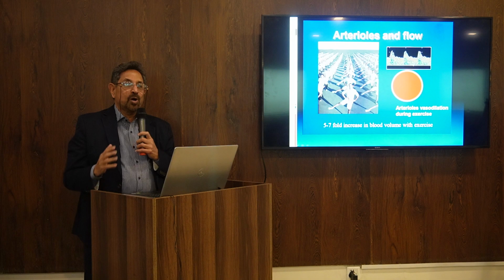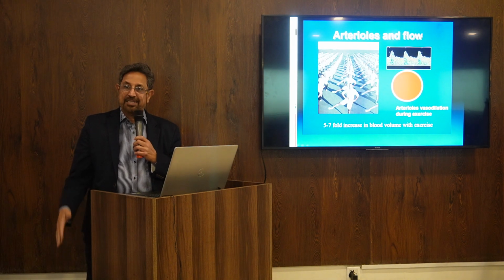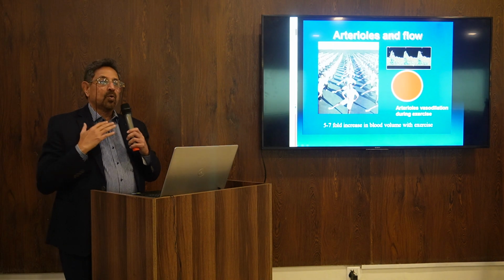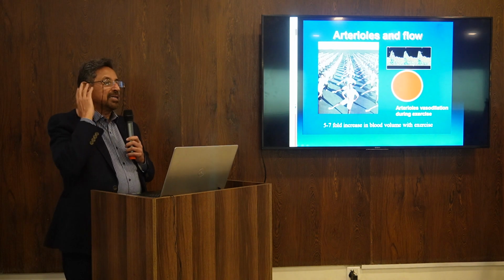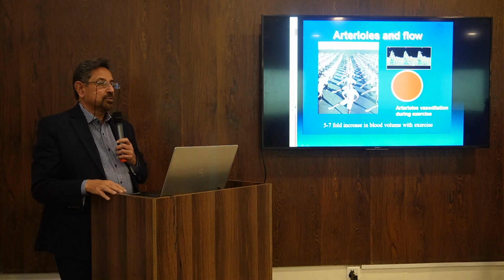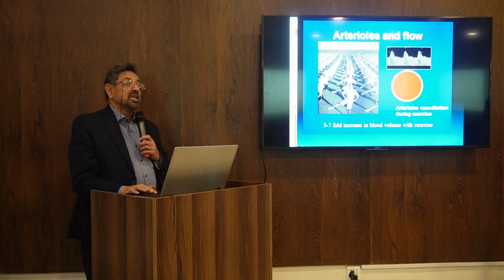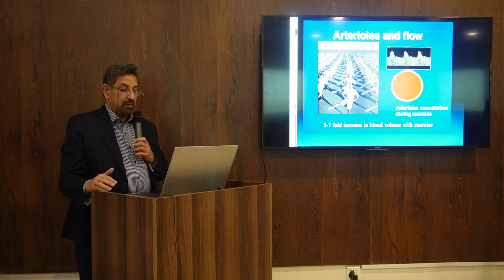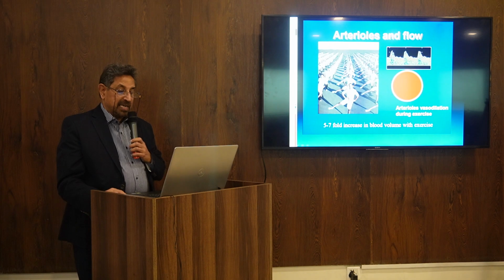It's said that you should always first make your feet wet, then legs, then the rest of the body, so there is vasodilatation and whole blood is pooled in the limbs and in the body. Little blood is left to go to the brain. It's the Bible. So if you start exercise or put hot water on your limbs, there will be vasodilatation and then good diastolic flow. Triphasic waveform is lost.